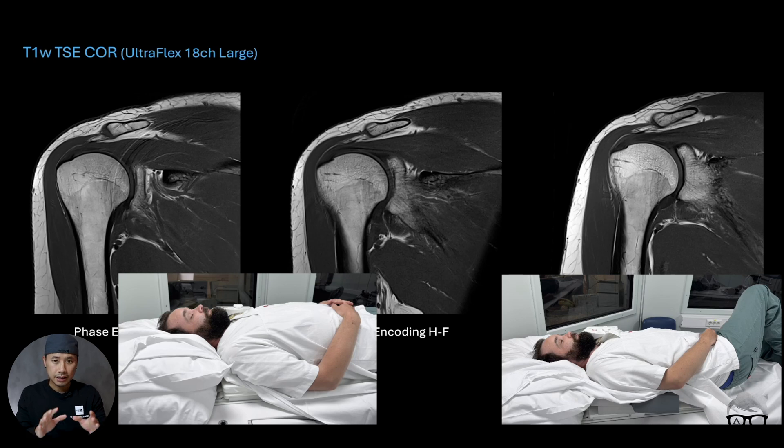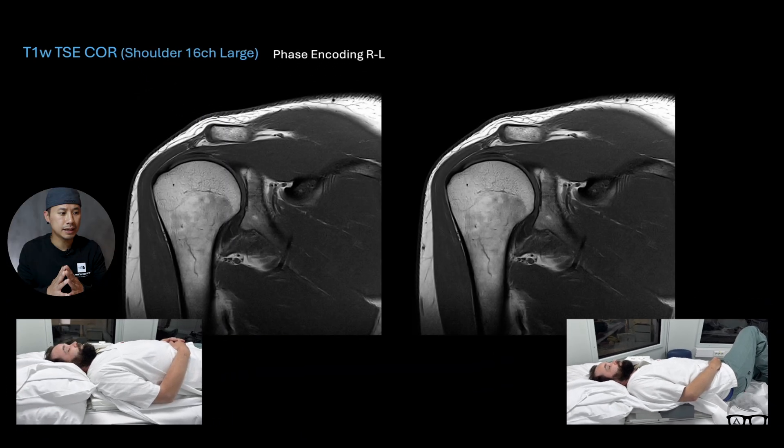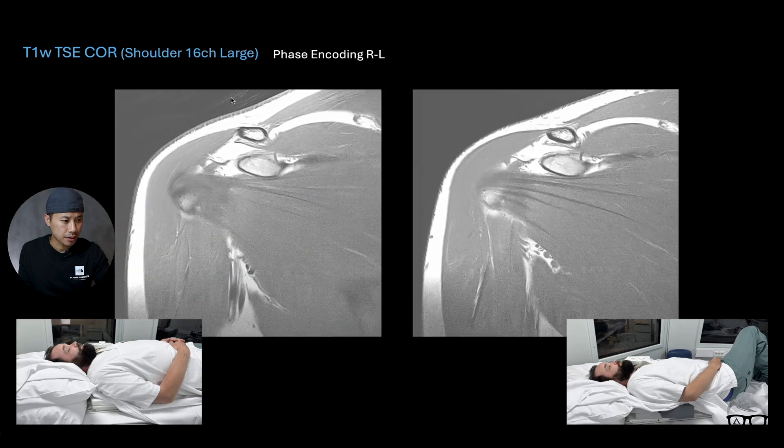I did a test on one colleague, and then I did another test on a second colleague. Now we have a dedicated 16-channel shoulder coil, which is a large coil, and we are using the standard routine phase encoding direction right-left. This is again a turbo spin echo T1-weighted image. When the test person was lying flat versus a little oblique — at first glance it doesn't look that bad, but if you enhance the window level a bit you can see there is some motion here, and it's much less in the oblique position.